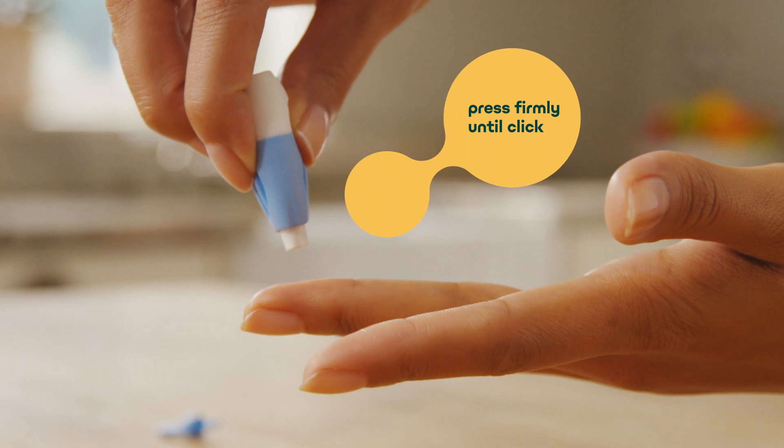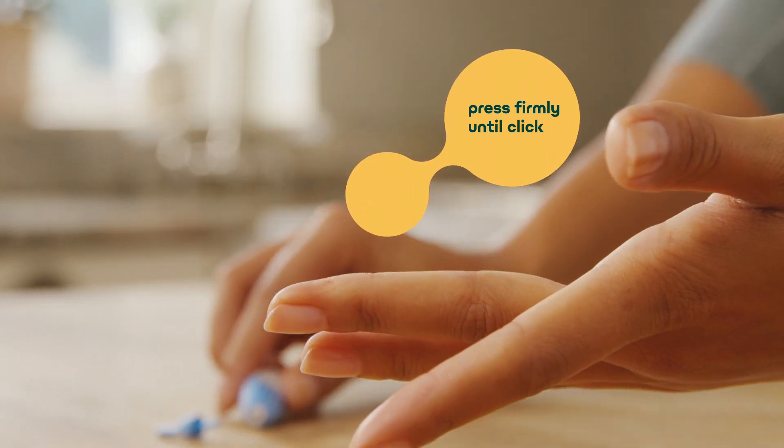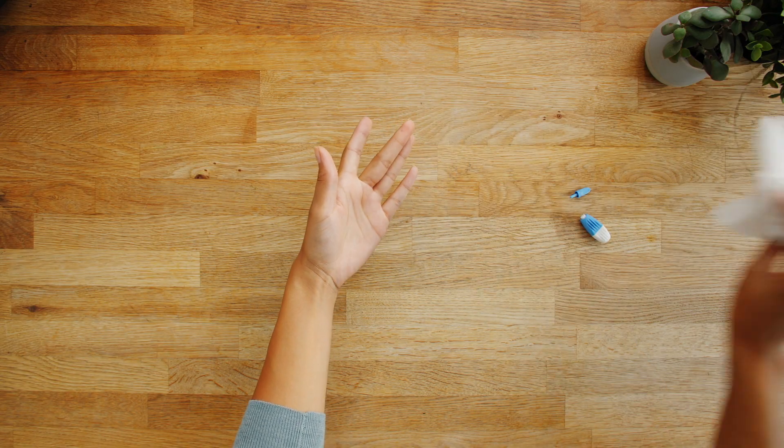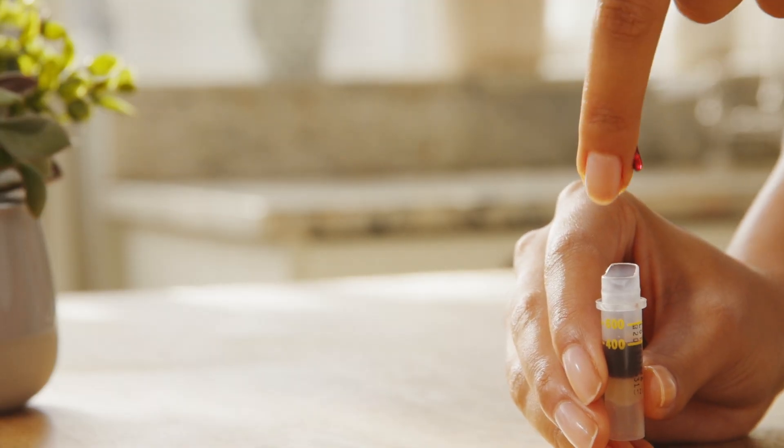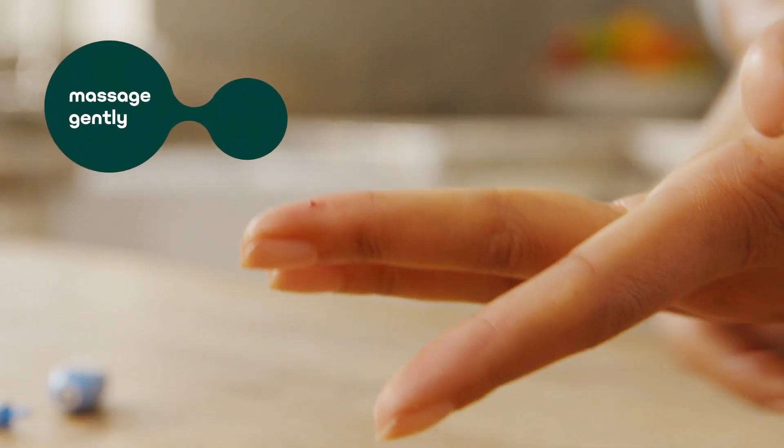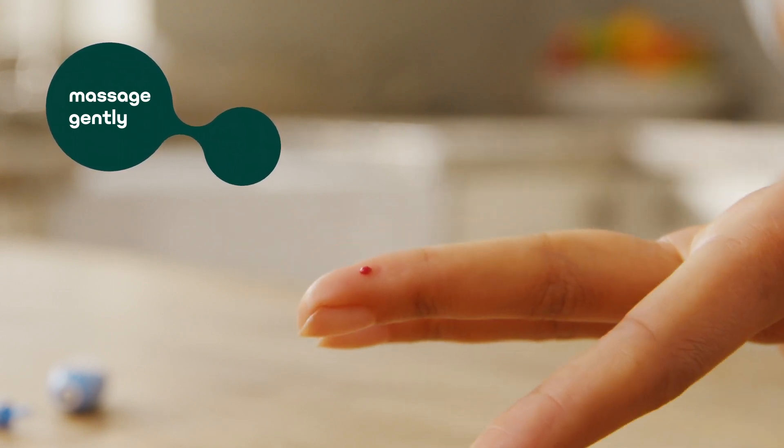Position the lancet on the side of your finger and press firmly against the skin until a click is heard. Allow a small drop of blood to form. Discard the first drop by wiping it away with a clean tissue. Position the finger over the collection tube and let the blood drop. If needed, gently apply pressure to the area surrounding the puncture site to encourage the blood flow until it reaches the upper fill line.